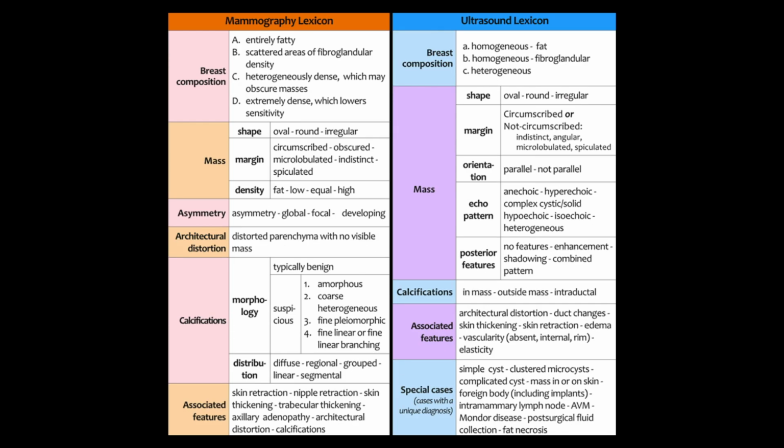Okay, and then this is just a chart that shows the ACR BI-RADS lexicon. So we have certain terminology that we like to use for mammography and for ultrasound. So you may see some of this terminology in your mammogram or ultrasound reports.